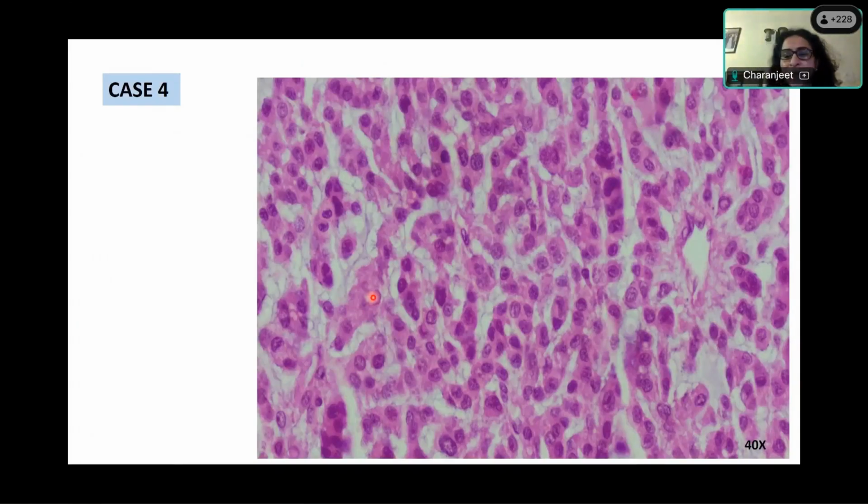Okay, and now look at the comment on the nucleus and the cytoplasm. How much is the cytoplasm of the cells? It is moderate. Yeah, a moderate amount. Okay. Moderate eosinophilic cytoplasm is there. So you are seeing all these pictures. Yes, people are writing in the chat box. You've even made a diagnosis. Very good. The diagnosis is correct. So you can see these cells.